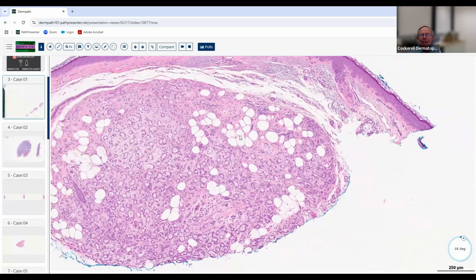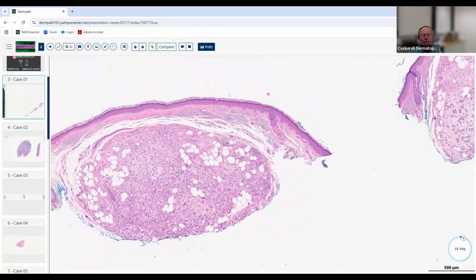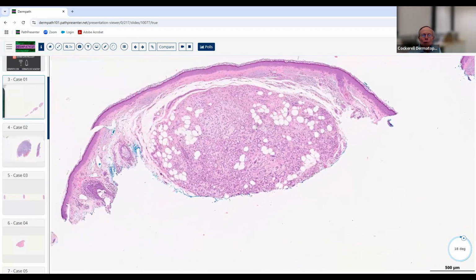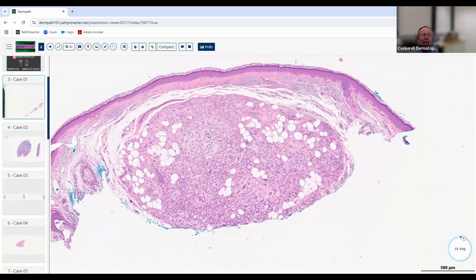It's been referred to as fatty metaplasia, where you get lipocytes that form in areas that are not really where the fat should be. And we see that sometimes in the upper reticular dermis, usually not so much in the papillary dermis. But here we've got it sitting in the middle of a neoplasm, which is interesting. So don't let that fool you. That's not a lipoma or anything like that. Sometimes the board likes to put a kind of red herring answer on there to try to throw people off because of something that may be unusual in the slide. And so don't fall for that. That's just what we call fatty metaplasia. That doesn't really mean much of anything.